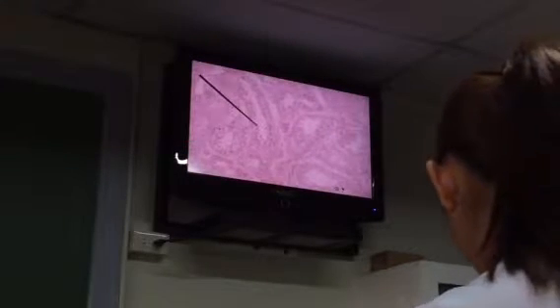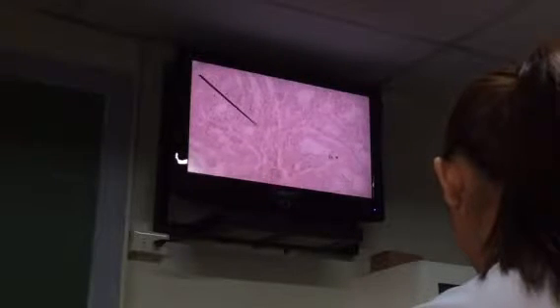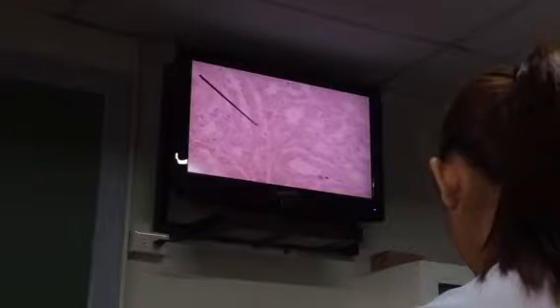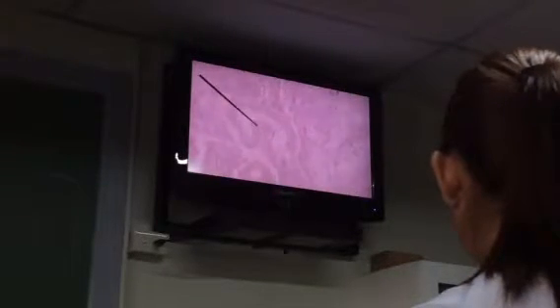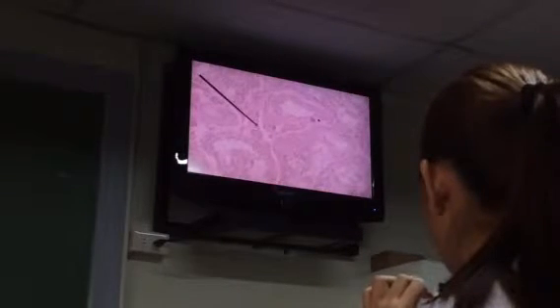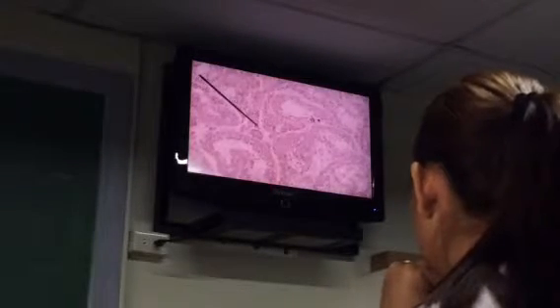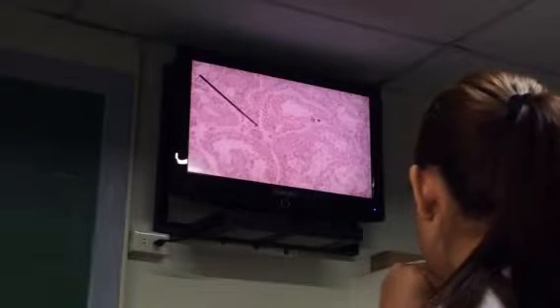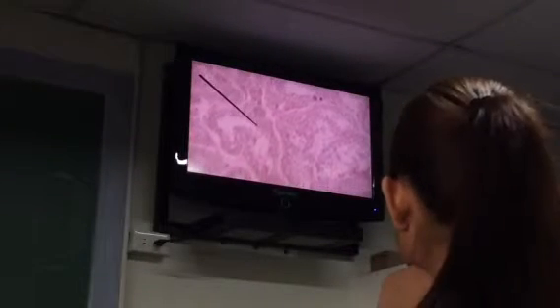All of these structures, of course, as we all know, are your seminiferous tubules lined by seminiferous epithelium. Now, when you say seminiferous epithelium, it's made up of the developing stages of your sperm cell. Okay? So again, just as a review, this is a seminiferous tubule, and do not forget that the highly eosinophilic cells in between your seminiferous tubules are your Leydig cells. Leydig cells, of course, are the endocrine portion, which secretes your testosterone. The exocrine portion, on the other hand, is your seminiferous tubule.